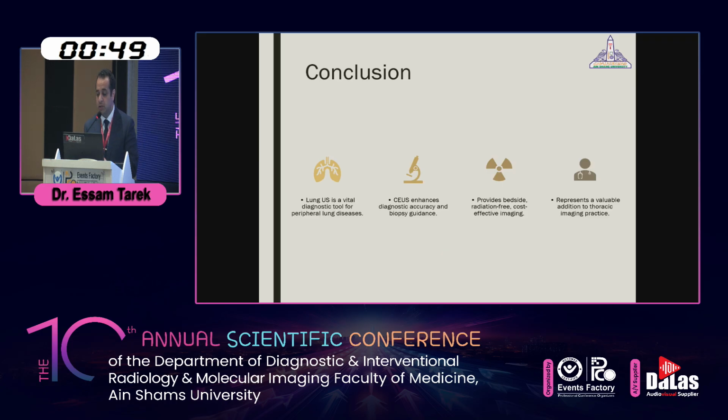For the conclusion, lung ultrasound is now an essential bedside diagnostic tool, particularly for peripheral lung disease. Contrast-enhanced ultrasound extends the role by improving diagnostic accuracy and guiding biopsy safely. Its cost-effectiveness and portability make it a valuable complement to CT and X-ray.